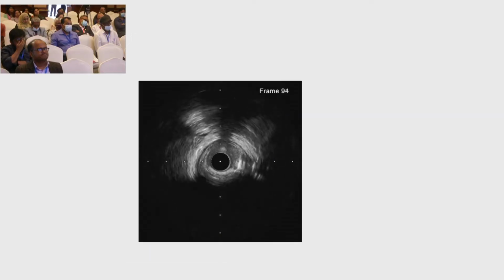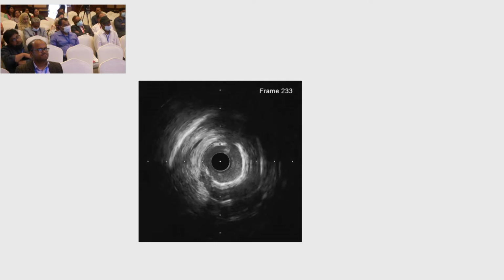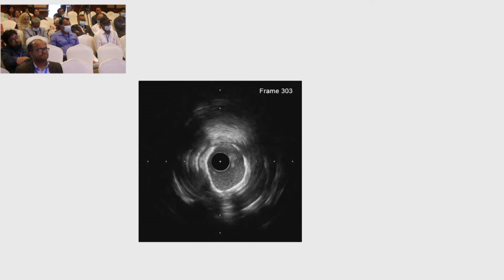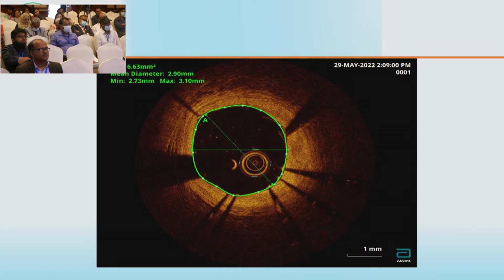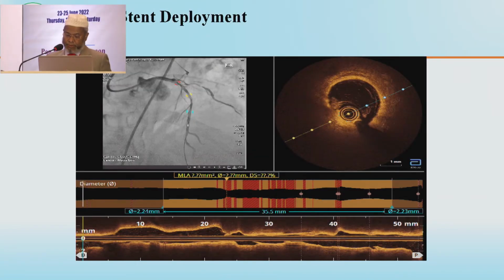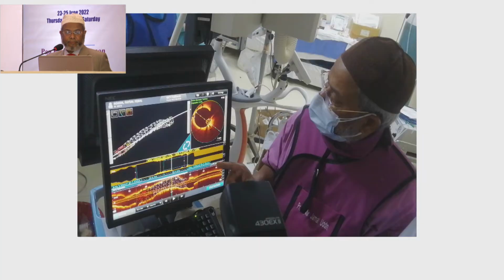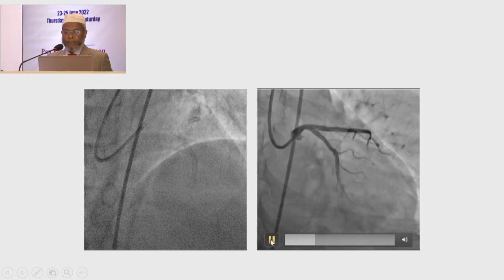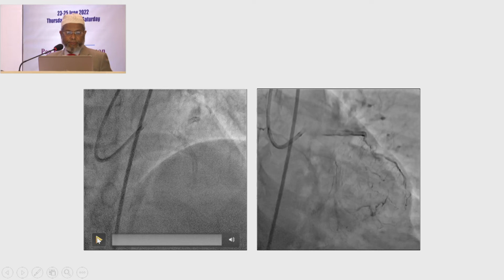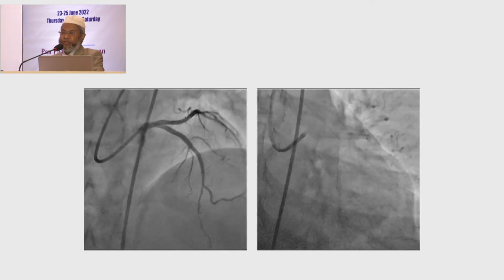And pullback after post-IVL. Here you see the fractures. And this is the final result after IVL and deployment of the stent.